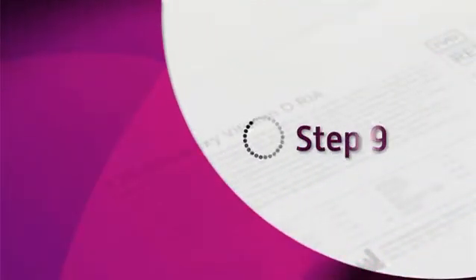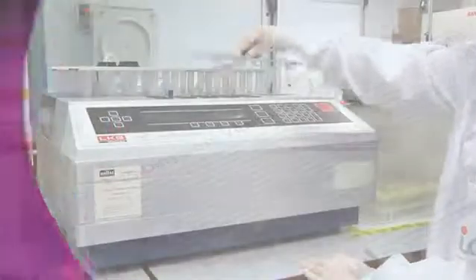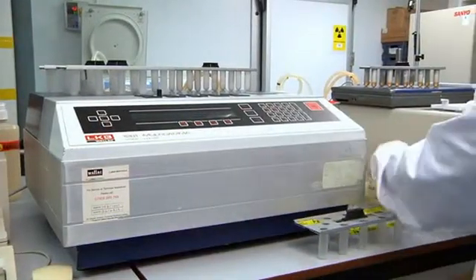Step 9: Count the tubes in a suitable gamma counter for at least one minute.